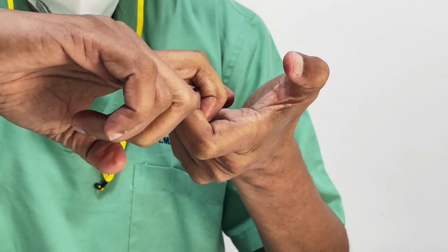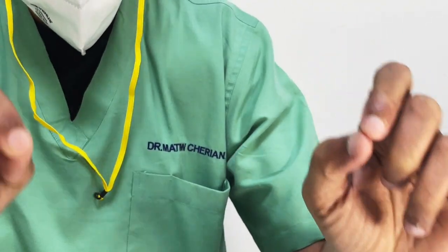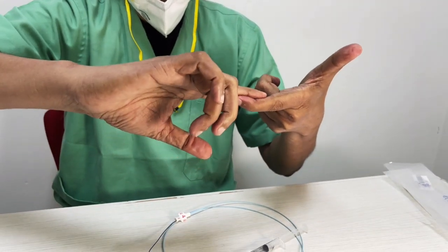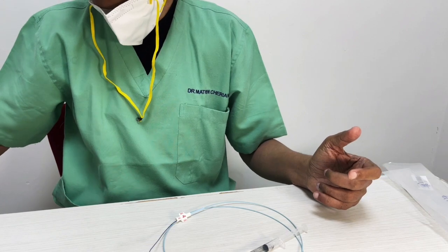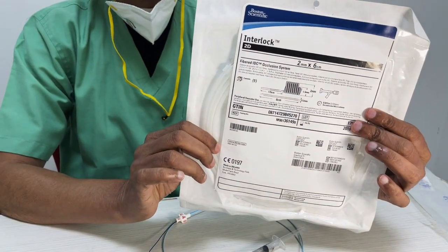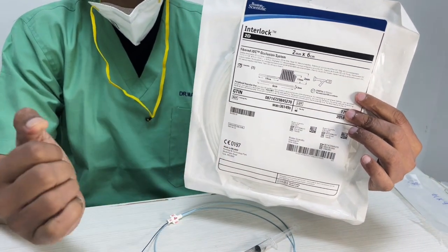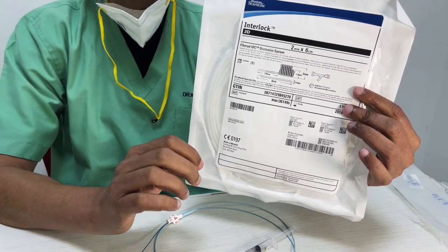Now this latch will work as long as it's inside the delivery tube or inside the microcatheter. As soon as it comes out, it just releases because the capacity of it to hold together no longer exists. So that is how this catheter is basically made, the detachable system. Once you push it out, it is detached. So it's not like the electrically detachable coil that you can pull it back in. Once it exited the microcatheter, it's over.